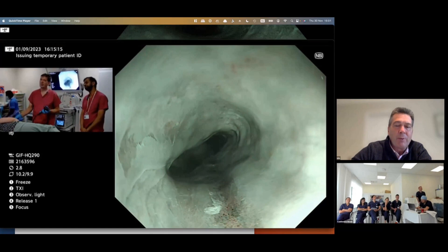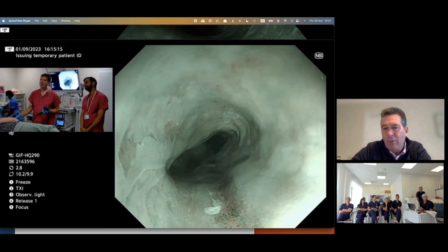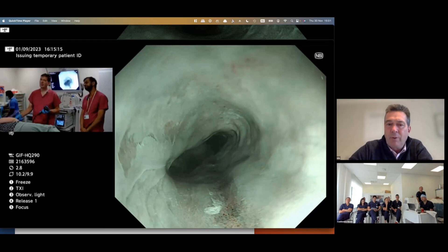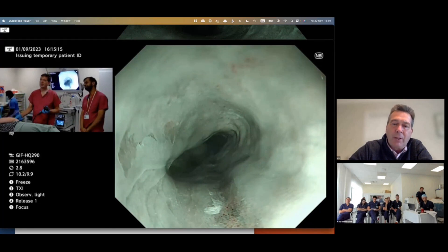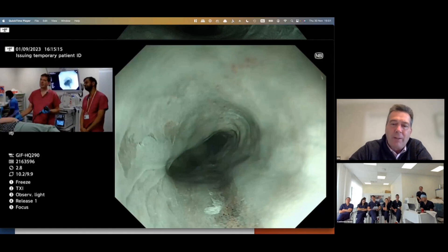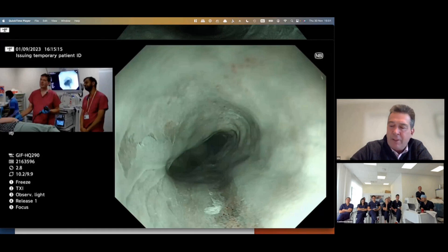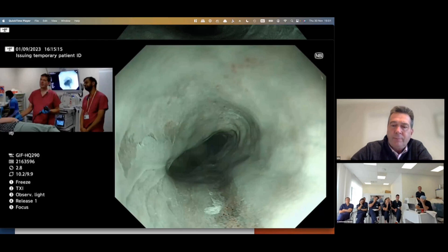Usually there's a distinct border between the squamous mucosa and that. You've probably got two - one at 6 o'clock here and one possibly at 9 o'clock there, which looks a bit unusual because they're usually nice and smooth and round. They're supposed to be an embryological evolutionary thing rather than something that's developed. The one on the left looks like something in creation, whereas the one at 6 o'clock looks more typical - it's been there for a long period of time. As the esophagus elongated, you've left this patch of mucosa at the top of the esophagus.